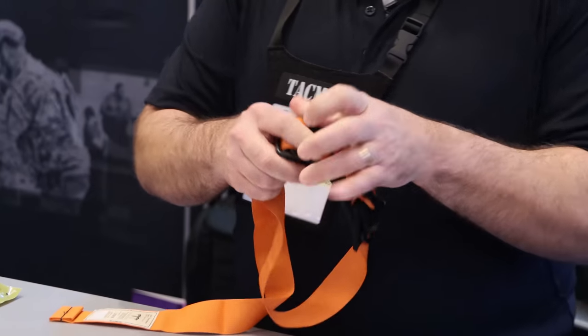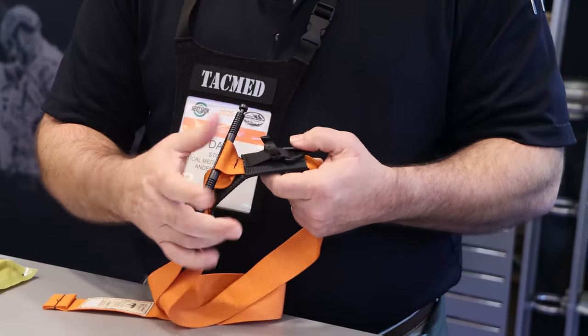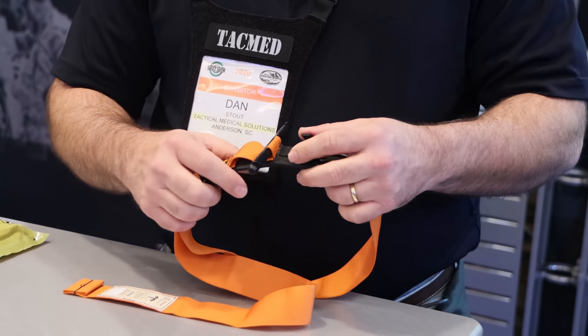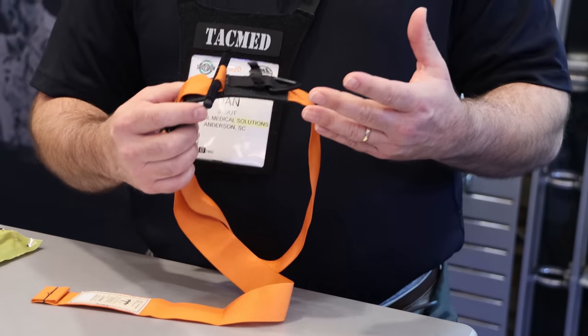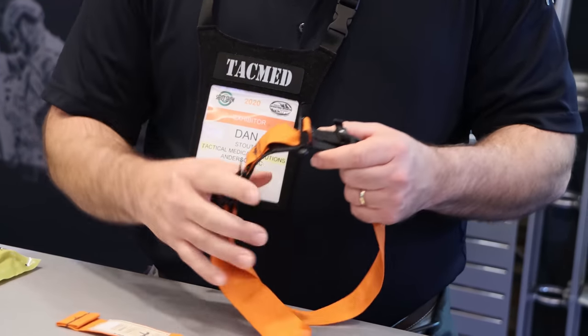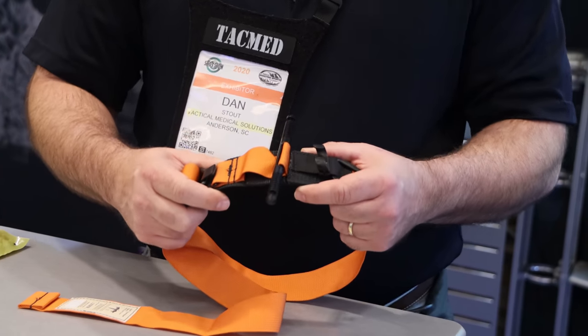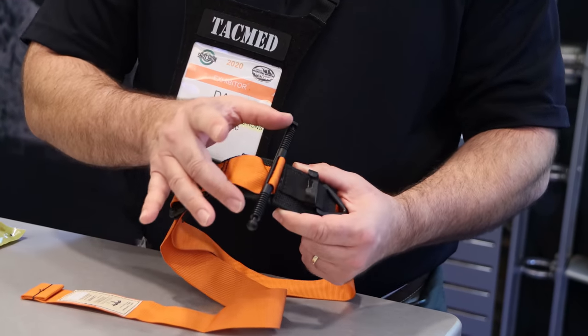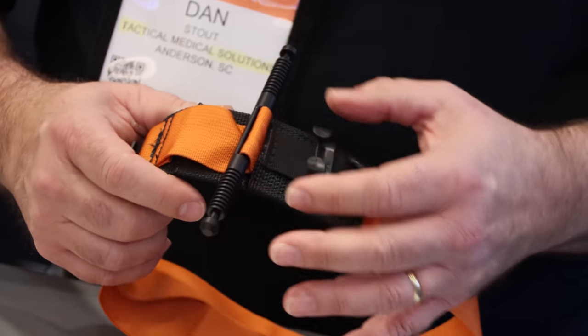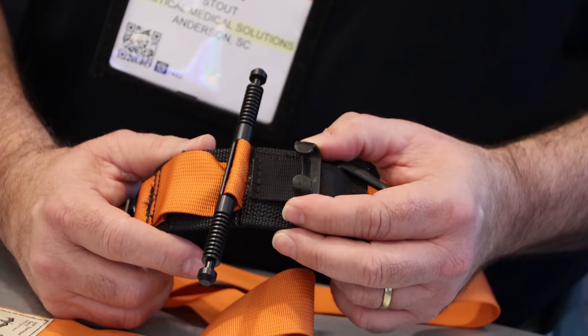The main difference between the Gen 4 and some of our previous generations was we addressed some of the feedback we've gotten over the years about our tourniquet being a little bit more challenging when applying it in the one-handed self-application mode. The modifications done for that were we lengthened up the windlass, skinnied it up a little bit, and we added a temporary assistance clip.